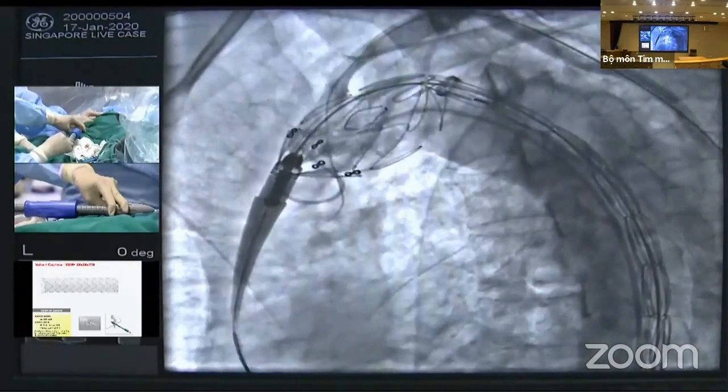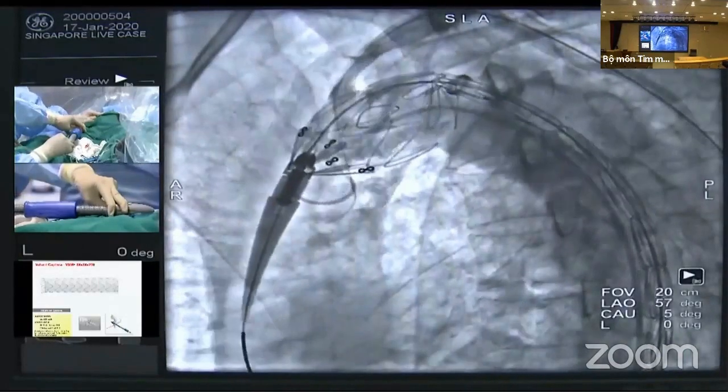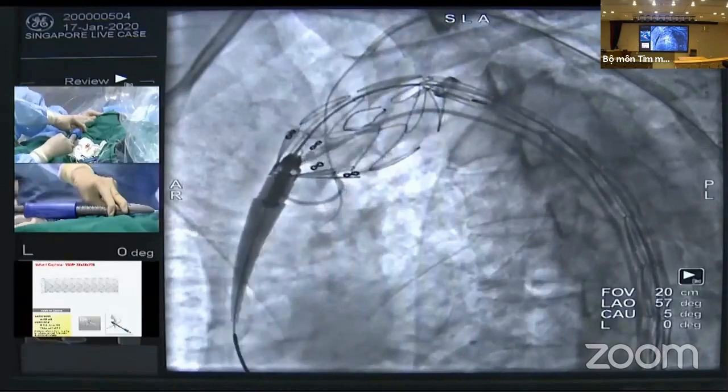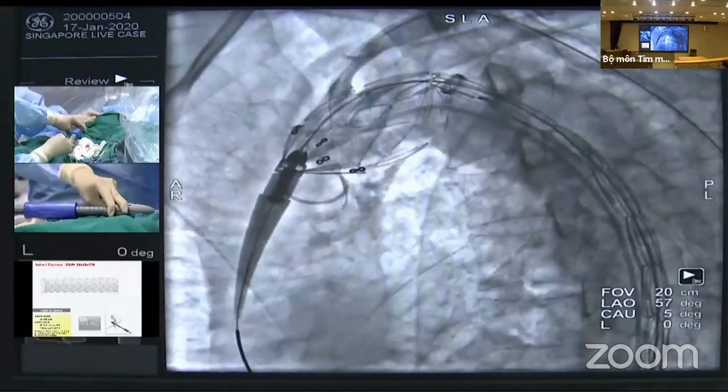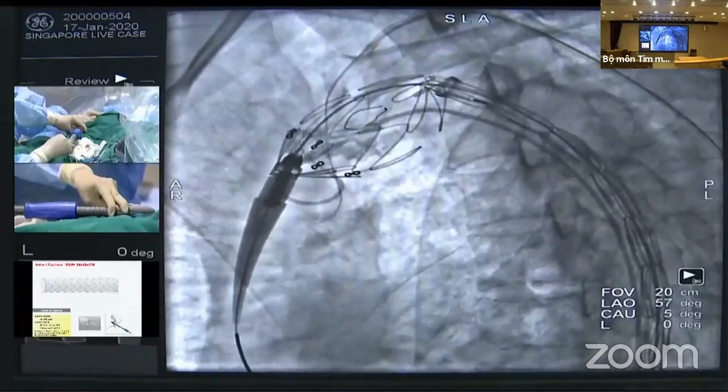Yeah. But when we do the bifurcated endografts and the iliacs, and Gore comes in with these preloaded wires, which makes life a lot easier. No. Unfortunately, we're looking at a 2D angiogram and trying to see if it lines up.